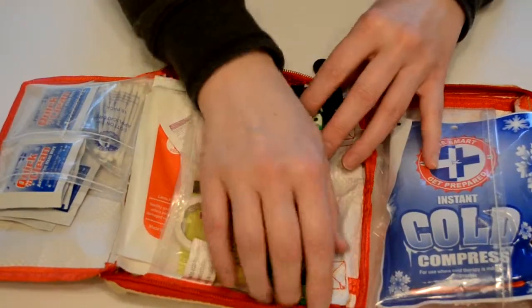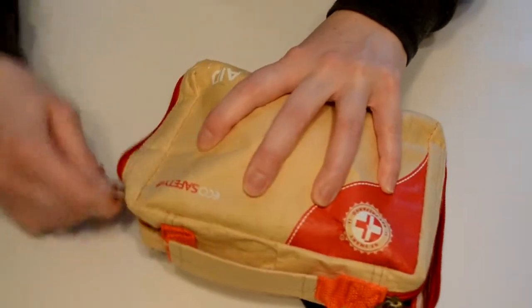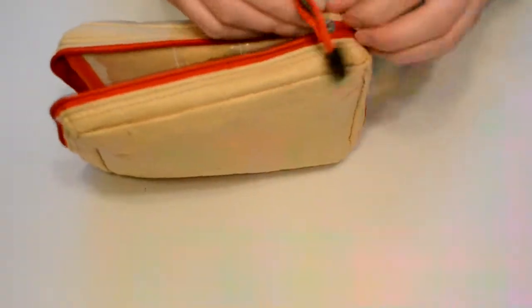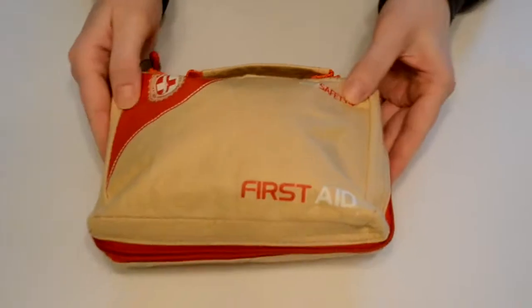It all comes in this nice carrying case and it's pretty environmentally friendly. The case itself does have some plastic on the inside, but on the outside it's a very nice material that looks fairly biodegradable. It has nice zippers on the sides so you can keep your first aid equipment all together and you don't have to worry about it falling out in your pack.